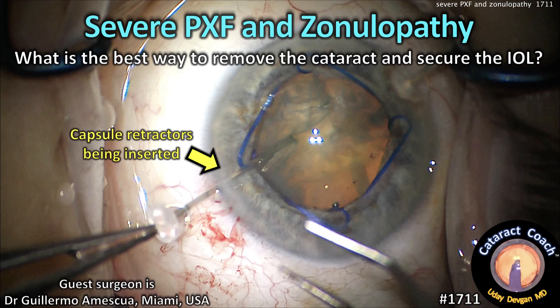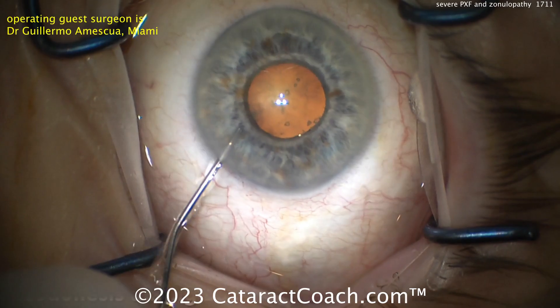CataractCoach.com. Severe soot exfoliation and zonulopathy. How would you remove the cataract and secure this IOL? Let's watch this case carefully.